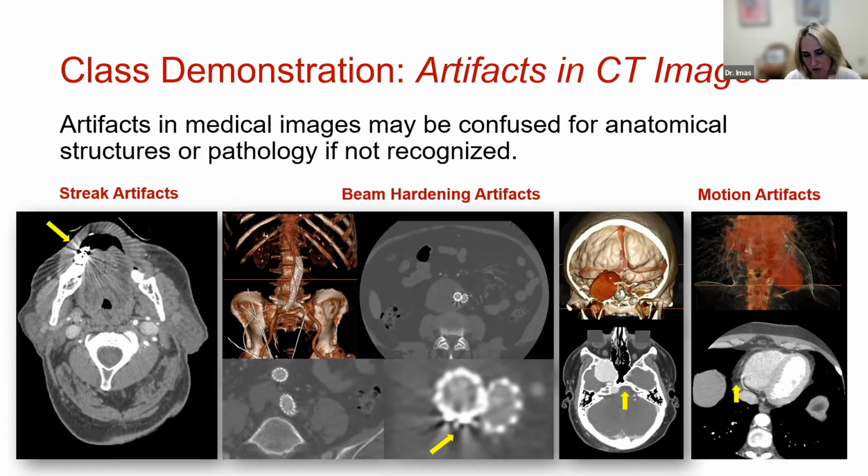We produce these artifacts. Some of them are common across modalities, some are different. So here I always do a class demonstration. Here's an example of artifacts in CT images. When I cover this unit or module on artifacts in computed tomography, I show a lot of examples.